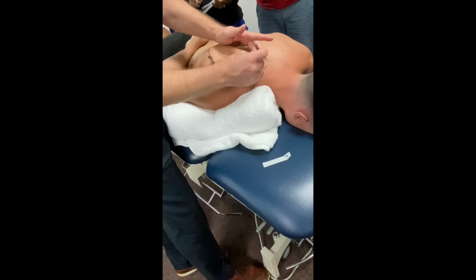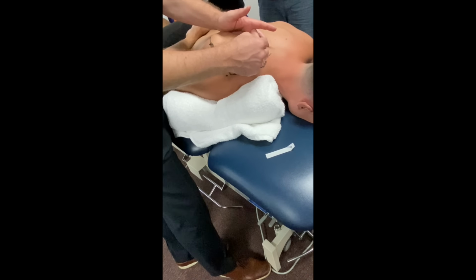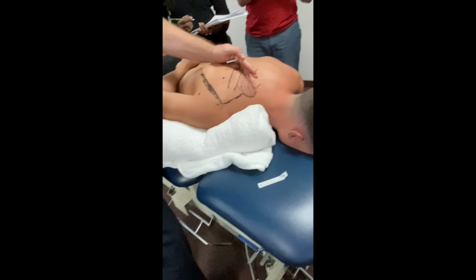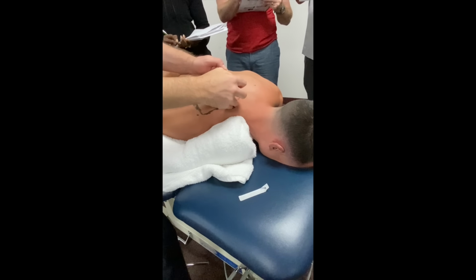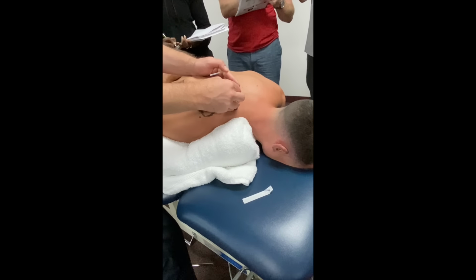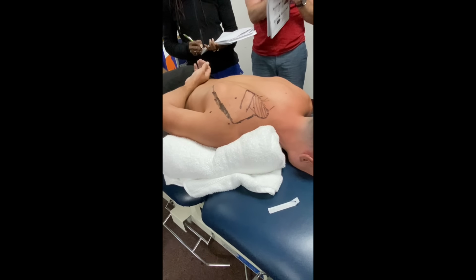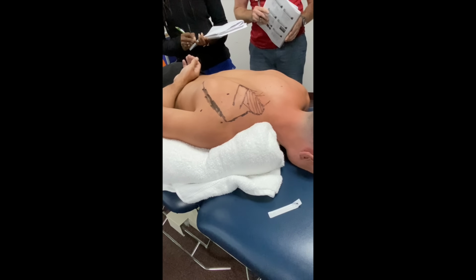So I'm going to take a needle. I'm going to stick it down right here. I am going a little bit in the caudal direction because I want to put the needle in a way which is perpendicular to the scapula. Okay. I'm going to take it right down to the bone just to see how much needle does it take for me to hit the scapula. That is a 40 millimeter needle, and I'm already hitting the scapula.